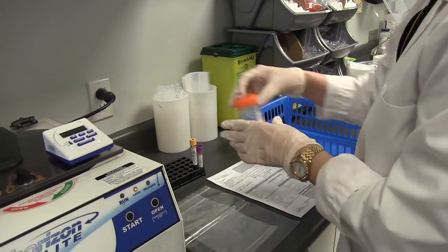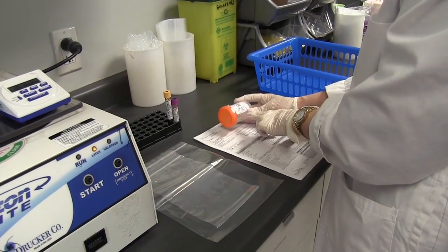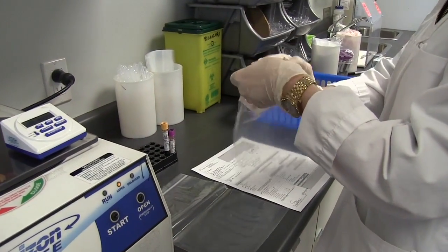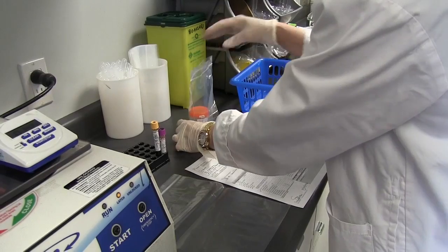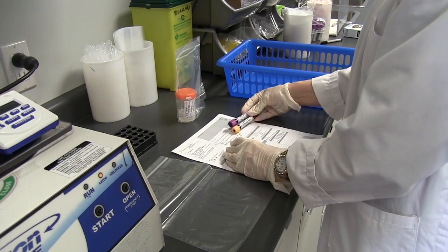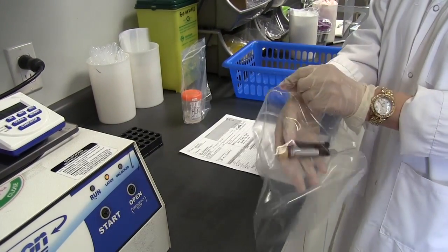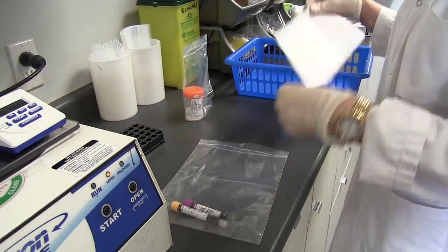Refer to the checklist in your kit for storage and centrifuge requirements. When packaging your specimens, cross-reference the labels on each container with the requisition form. Place all samples in Ziploc bags keeping urine and tubes separate. Remember to always send the requisition form with the samples to avoid any delays.